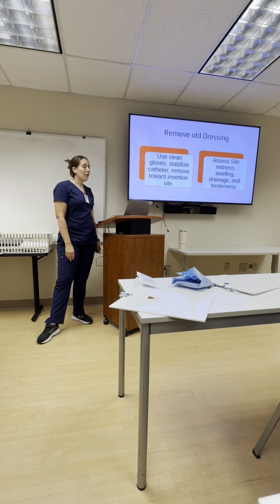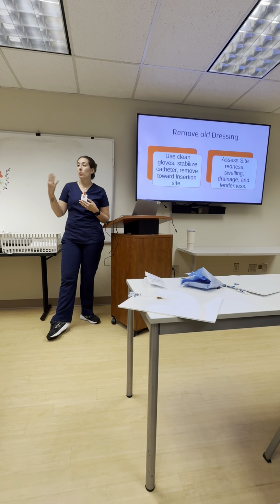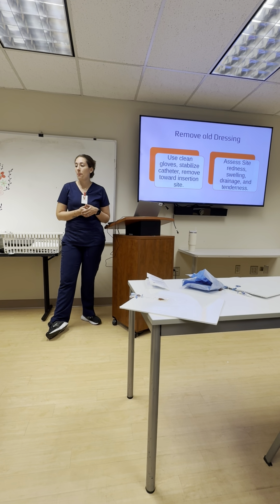Once you have your dressing off, we want to assess the site. Is there redness, swelling? Is it tender? Is there any discharge? We just want to remember that when we go to document later, as well as telling our provider if there are issues with the insertion site.